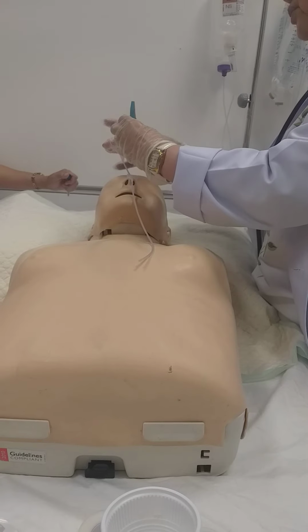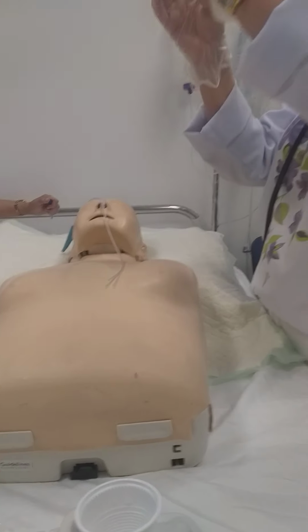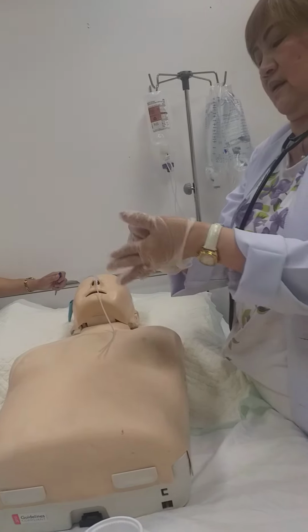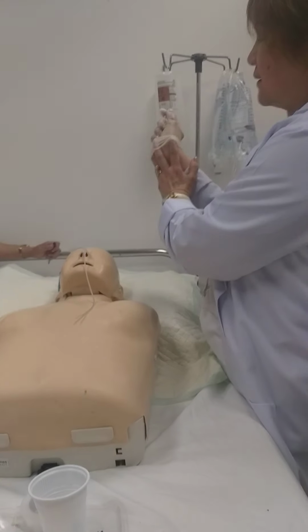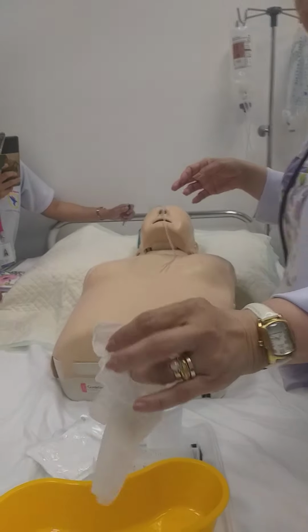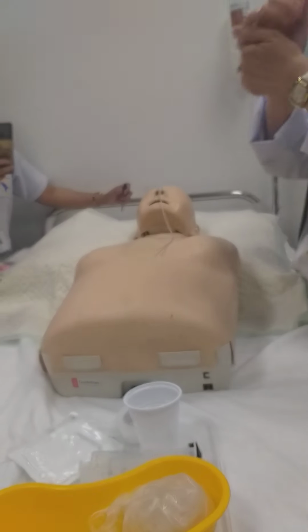Butterfly means, you see how difficult it is with the gloves. I will remove my gloves first, okay? In removing your gloves, hold in the middle. Clasp it from under, out, the whole thing. I don't want something to just hang and hang. Put it in the receptacle. Anytime, before and after, hand hygiene.